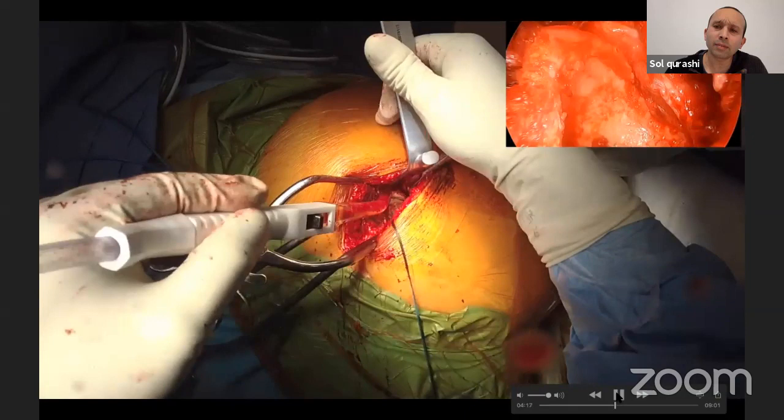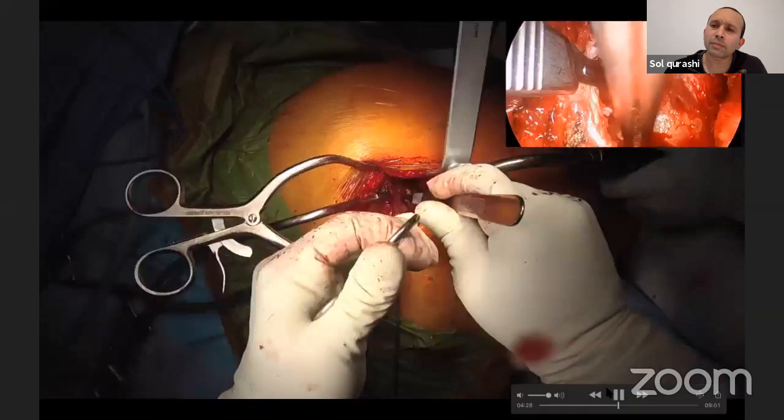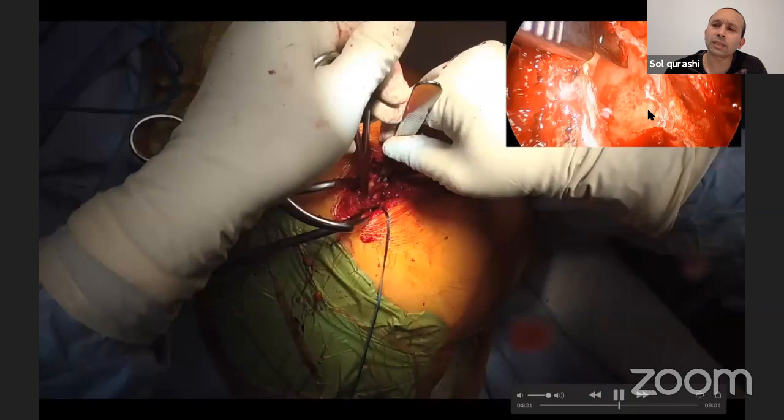Like so, and you just basically put the knife on the inside of the acetabulum, and it guides you, and it comes out as a large piece. The tip of my knife there is at 12 o'clock now, and I'm just putting a little bit of traction on my Kocher here, and it basically just peels off very nicely.